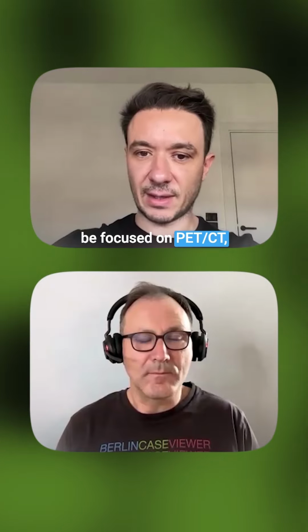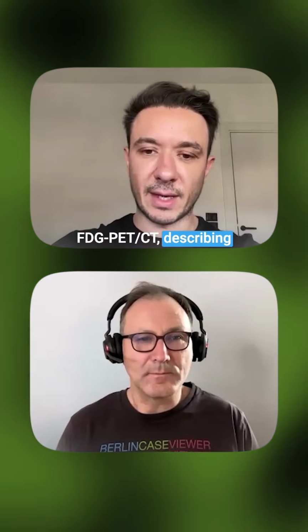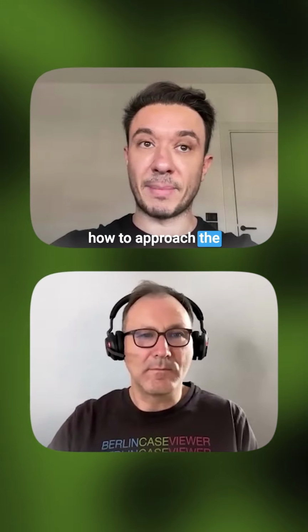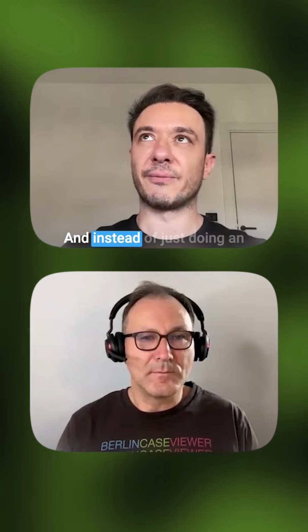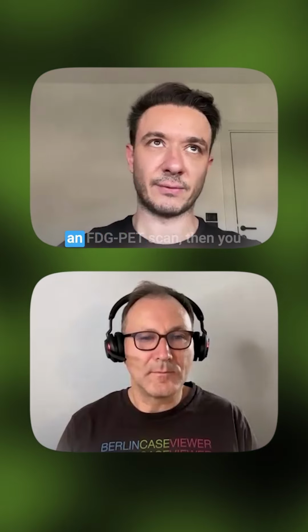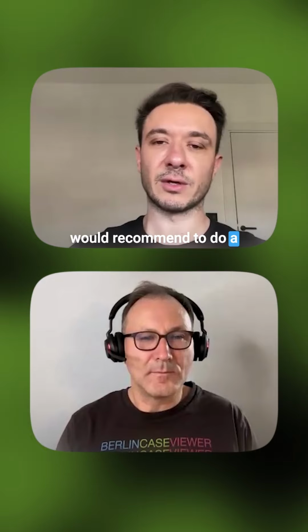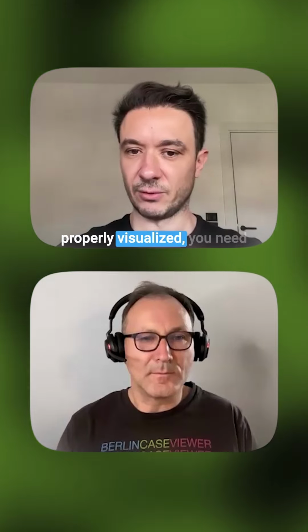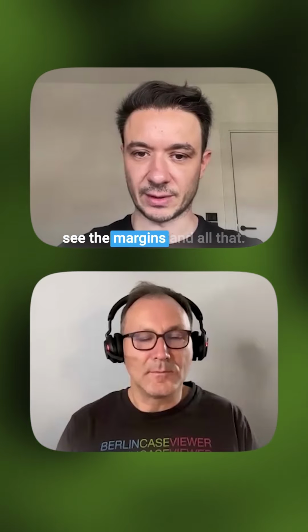The next course would be focused on PET-CT, FDG PET-CT, describing the anatomy, of course, detailed anatomy, and how to approach the PET scans, basically. Instead of just doing an FDG PET scan, for example, in lung cancers, you would then recommend a contrast-enhanced CT if the lesion or the mass was not properly visualized. You need to measure it and see the margins and all that.